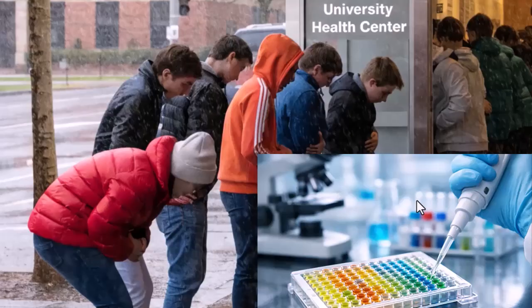Let's walk through the cafeteria outbreak scenario. You suspect a pre-formed bacterial toxin because symptoms appear within hours. Mass spectrometry is accurate but slow and expensive. Instead, you choose a toxin ELISA.